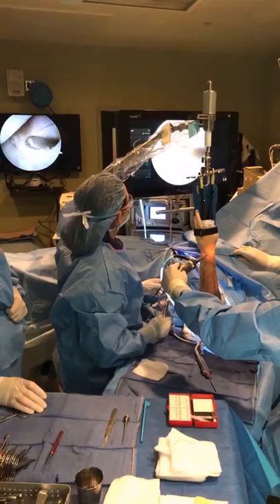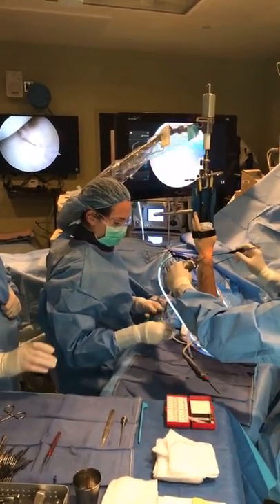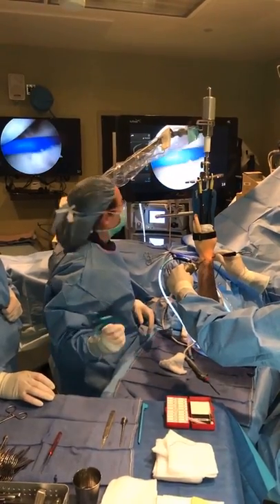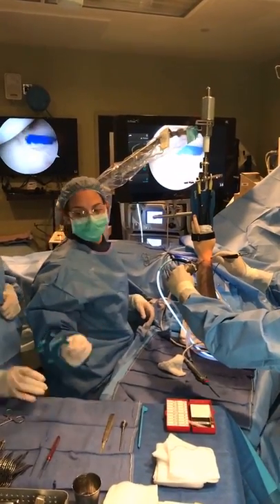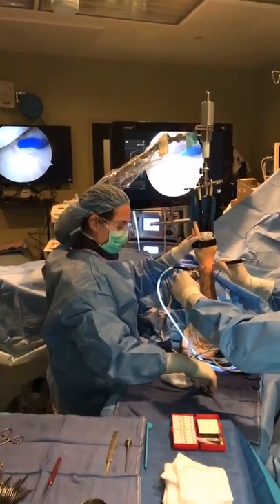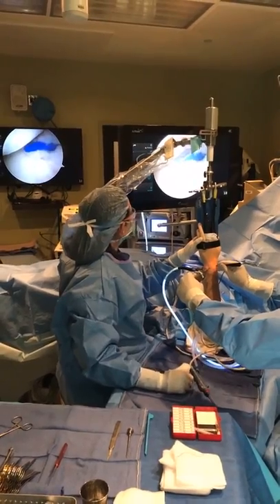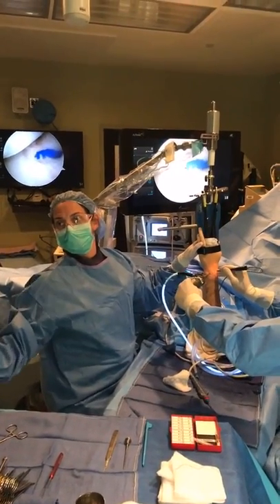Okay. We are almost done. So people say, oh my God, I have to have surgery. I go, well, it's arthroscopic. I just saw a woman who needs a shoulder. I gotta do something with her shoulder. She's all nervous. And I said, look, it's just a couple little holes. You know, it's a whole different world now.